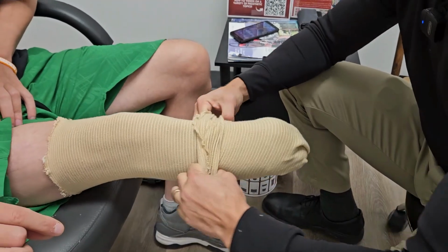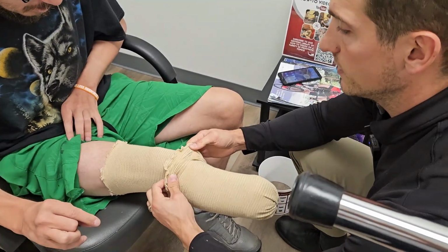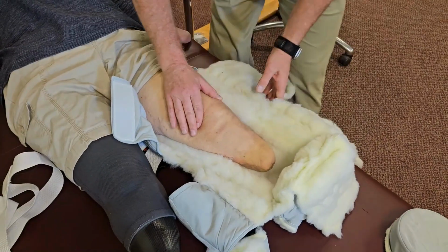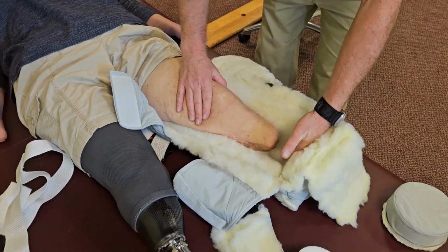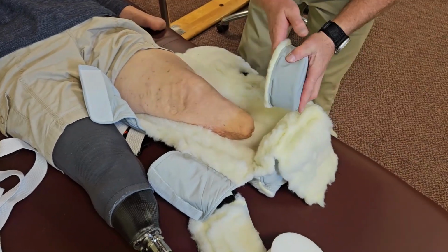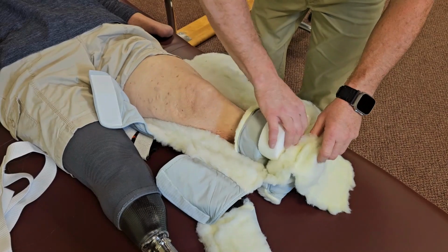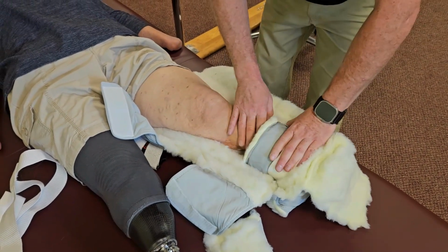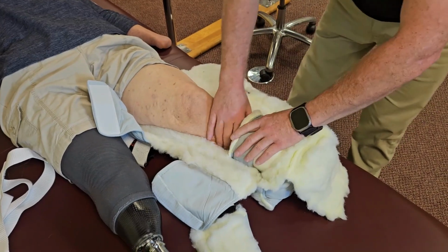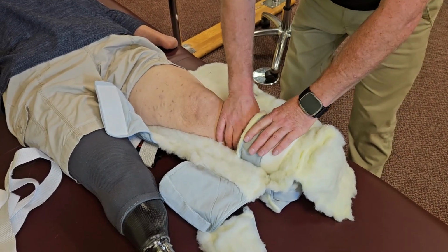Some of the other things that we do post-operatively, he'll probably have this picture back up before we know it, is the Rook. The Rook is a post-operative device that helps keep their knee from becoming contracted. We don't have one for transfemoral, but for the transtibial, it's kind of a light compression or a light protection. It's not going to help greatly with a direct fall.